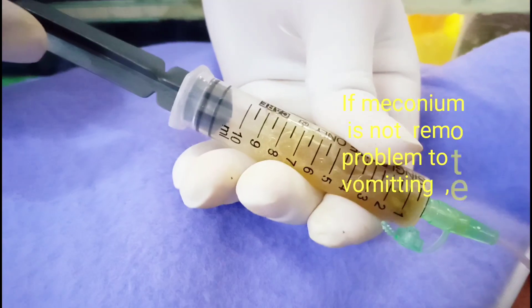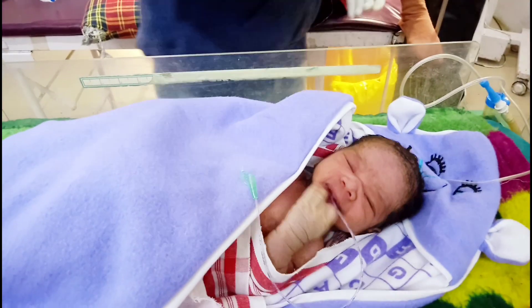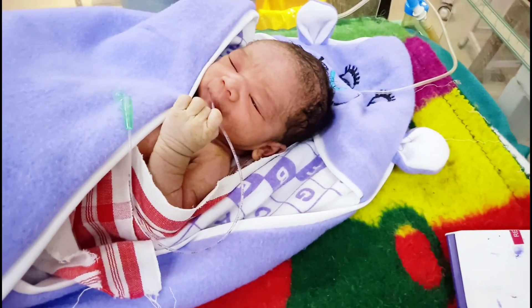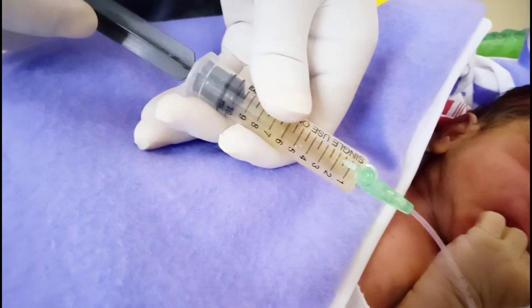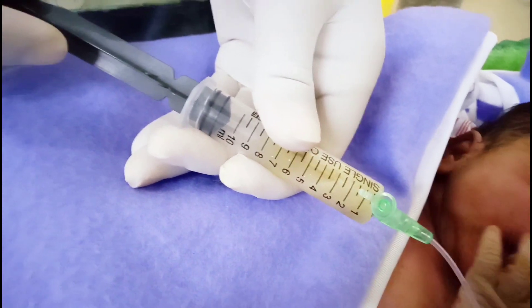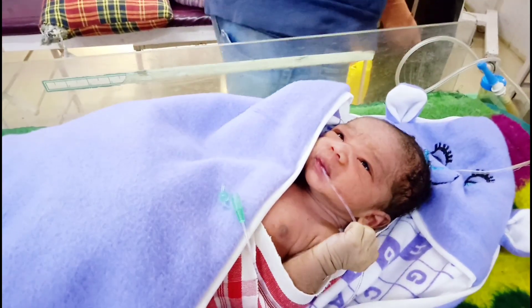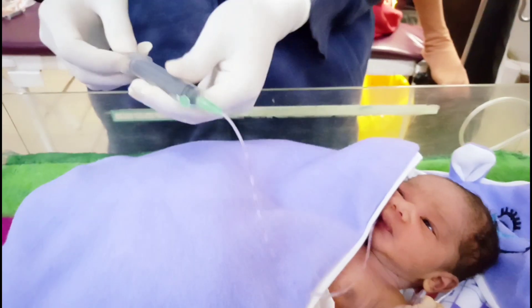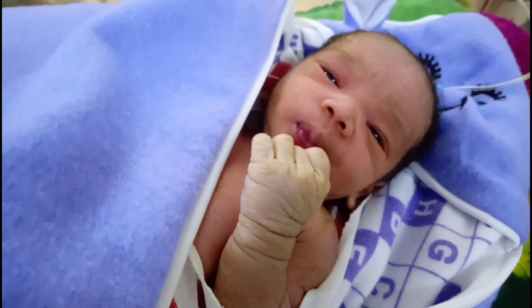And then suction it back so that dirty meconium comes along with the normal saline, as we see in this video. That's how the dirty meconium is washed away.